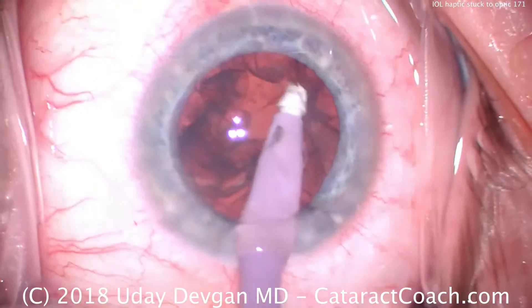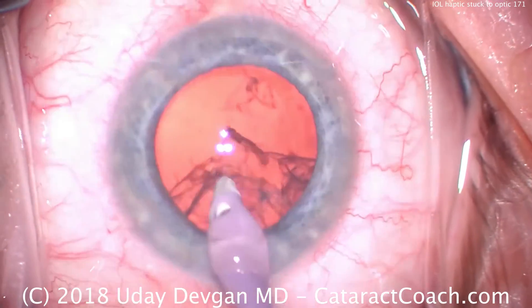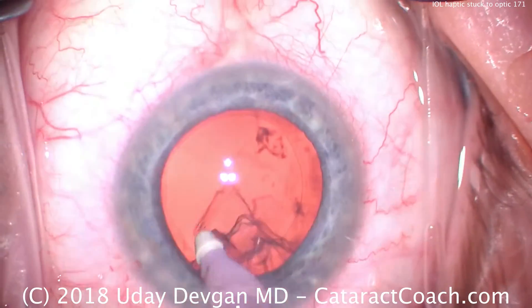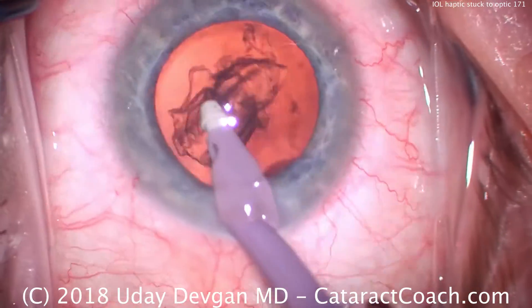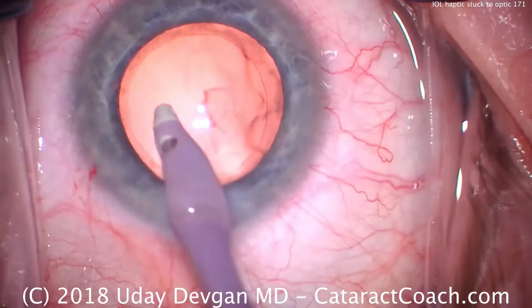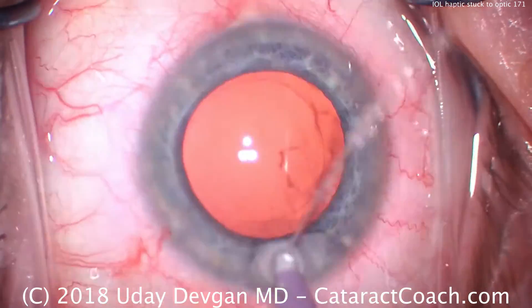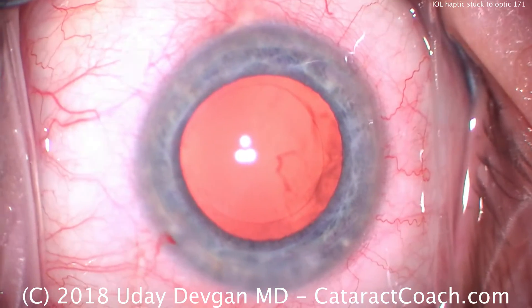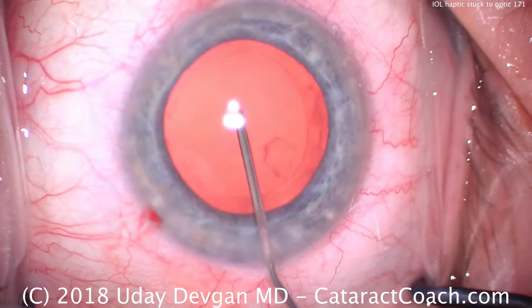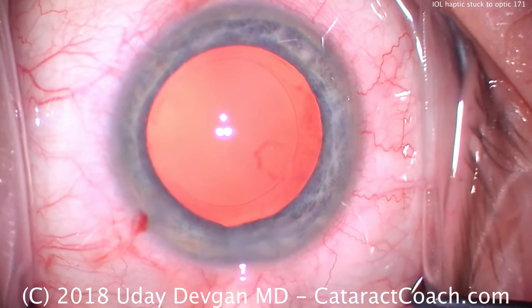Sometimes we'll run out of viscoelastic. In a case like this, which is a larger myopic eye with a bigger anterior chamber and higher anterior chamber volume, we're using the smaller sizes of these syringes of viscoelastic. In this case the technician ran out of viscoelastic, so there's a little bit less than an ideal amount in the injector. We typically put the dispersive in the injector; this is the cohesive now, filling the capsular bag. I certainly would have liked to add this to the injector had I known, but the technician didn't alert me.